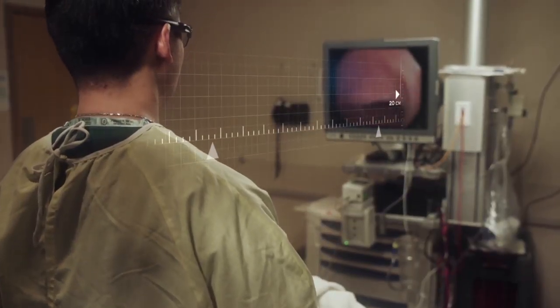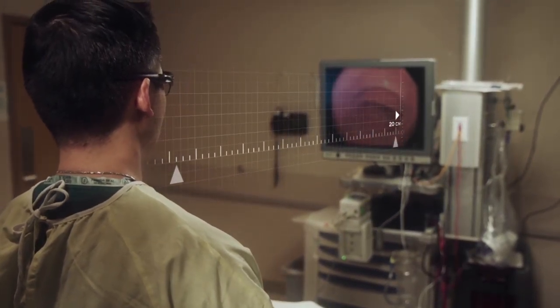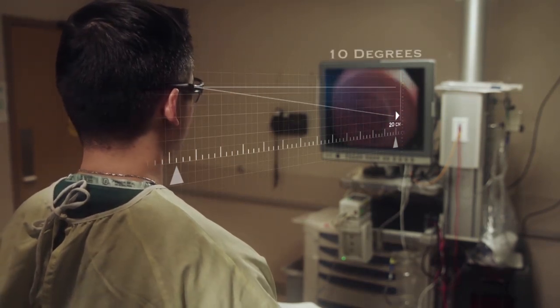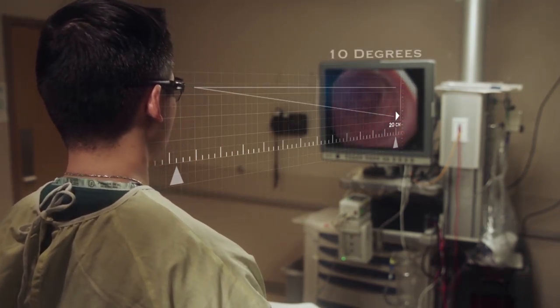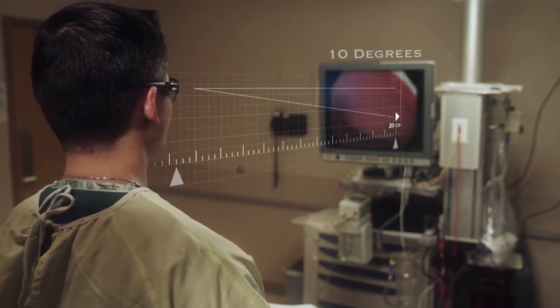Endoscopists come in all sizes, so your monitor height should be adjustable. The endoscopist should adjust both the bed and the monitor to optimal heights before performing endoscopy. Monitor height should be at 20 centimeters below the height of the endoscopist, which places the center of the image at approximately 10 degrees below the horizon to minimize neck flexion and maintain the natural curve of the cervical spine to reduce neck strain.